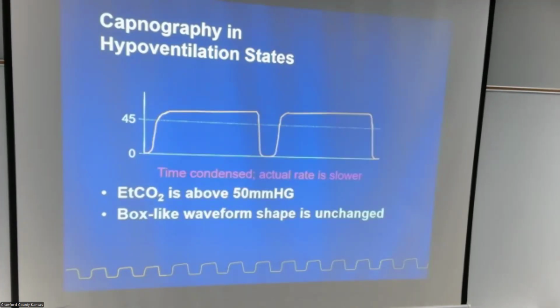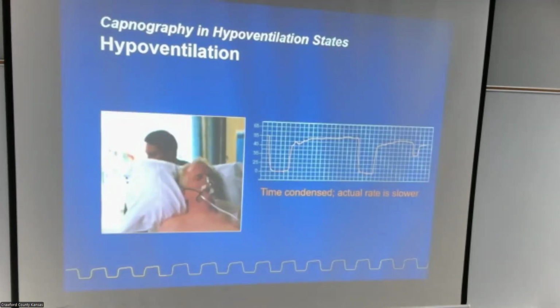So this is going to be a hypoventilation state. Tall, wide, and slow. We do not like this state. We would rather have the other state.